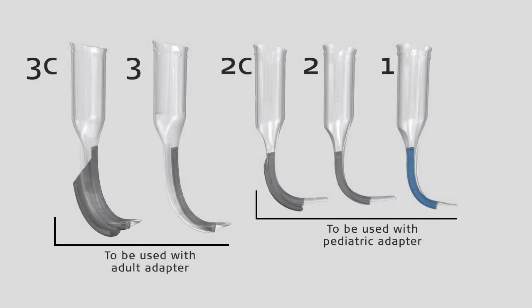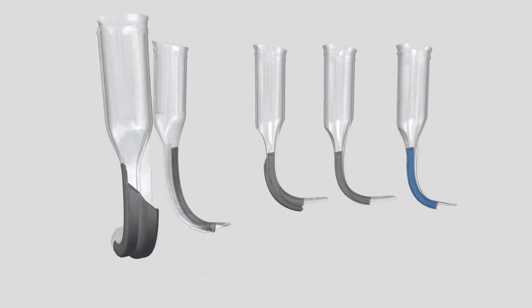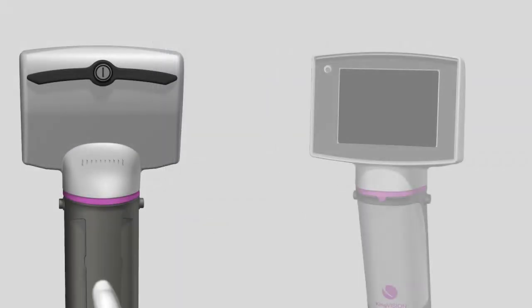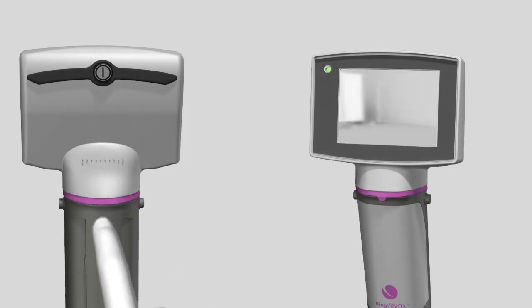To attach a disposable A-Blade, first choose the appropriate size based on the patient's age, size, and other relevant factors. Select either the channeled or the non-channeled variant based on preferred tube delivery technique. With the display locked into the video adapter, press the power button to turn the device on. Confirm that the screen shows a live image.